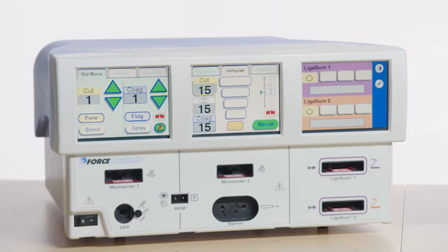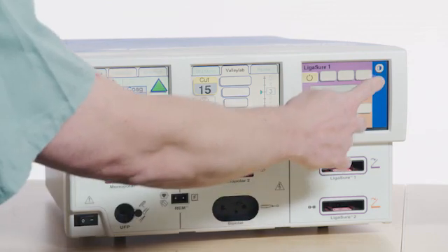Verify that the REM alarm indicator illuminates red and the REM audible alarm sounds. To verify the audio, enable the demo mode on the Force Triad by touching the wrench icon and then pressing Enter.